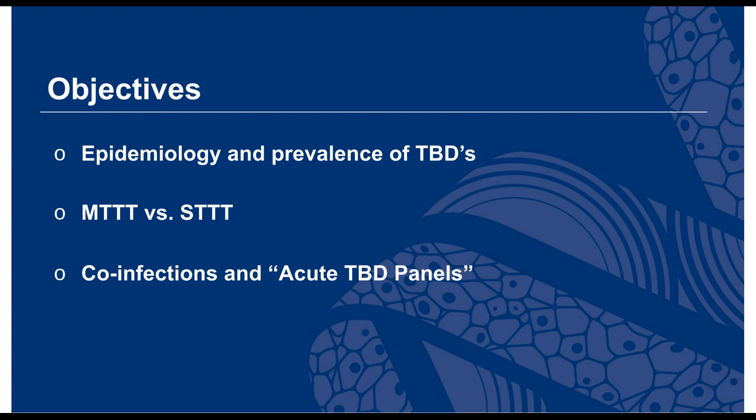I want to take this time to introduce abbreviations, which there's no shortcut. I think you're going to have to get used to these terms, MTTT and STTT. I will explain that in a minute. These are the paradigms. These are the names of the tests we use for serologic diagnosis for tick-borne diseases.